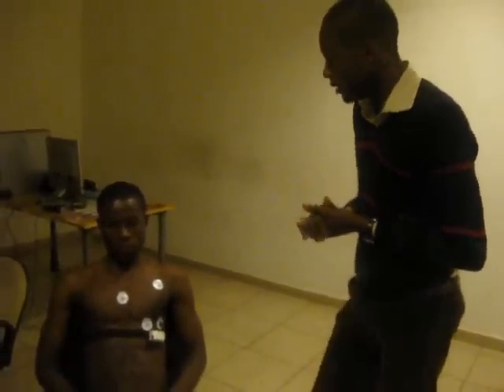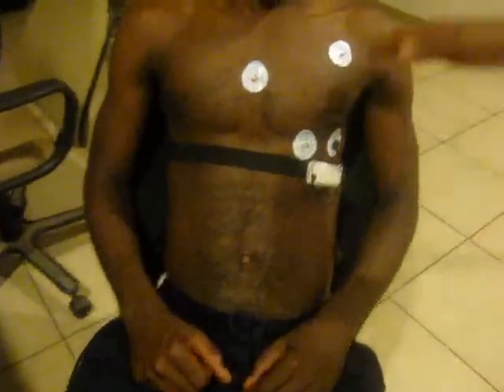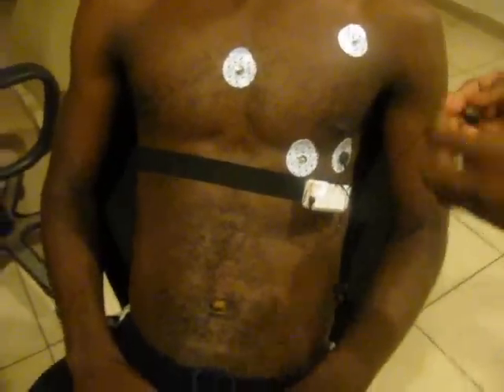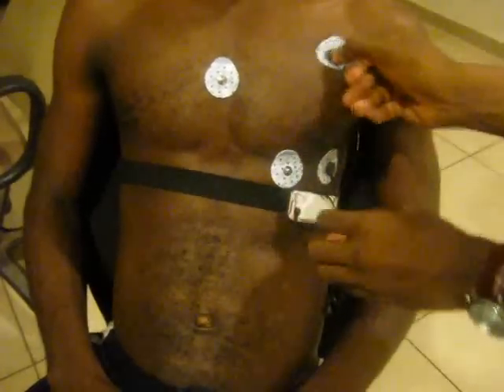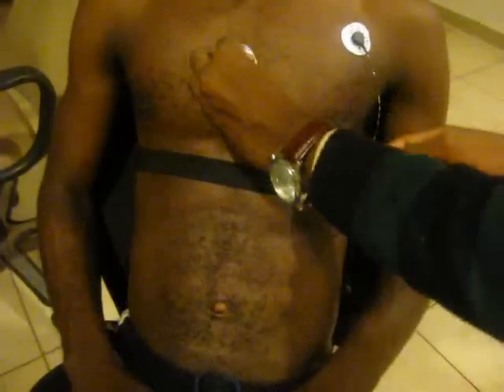Using the CardioPath, the nurse will perform an ECG examination for this patient. To do that, she will first place the electrodes on the chest of the patient and then connect the electrodes to the input of the Bluetooth ECG signal acquisition module.